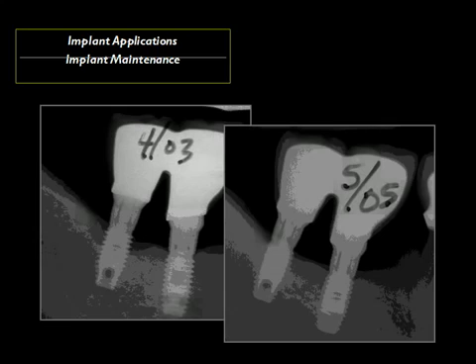The value to this individual was incredible because we were considering sectioning off this unit, removing this implant, allowing it to heal and replace. The value to this individual was incredible. And we were able to do this only because we had precise equilibration methods available to us.